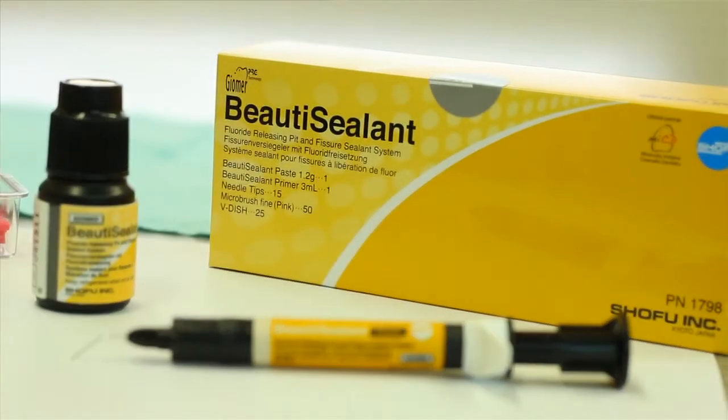Hello, my name is Lisa Wadsworth. I'm a registered dental hygienist and I'm here today to tell you a little bit about Beauty Sealant by Shofu. I had the opportunity to learn about the product and then bring it into the dental practice and use it on some patients.